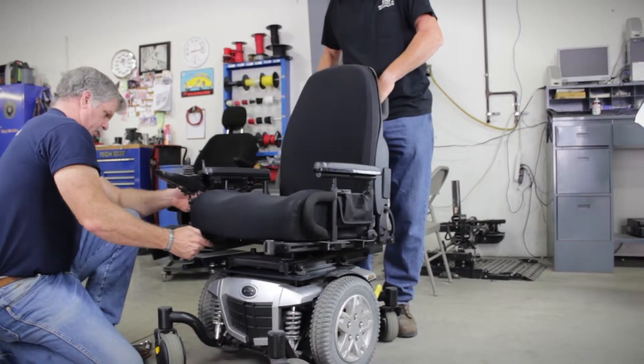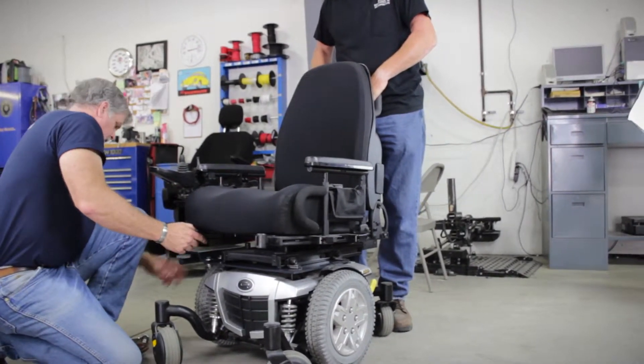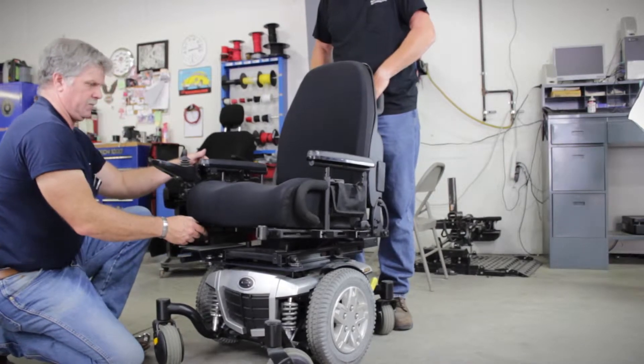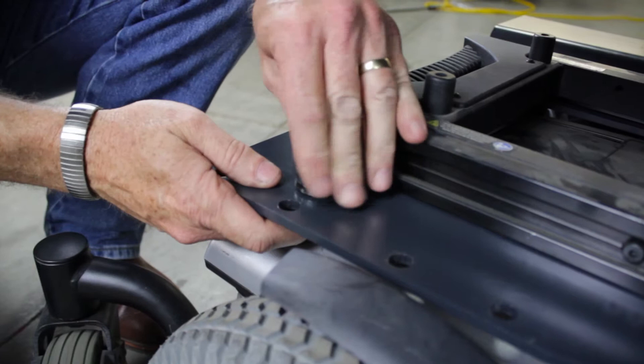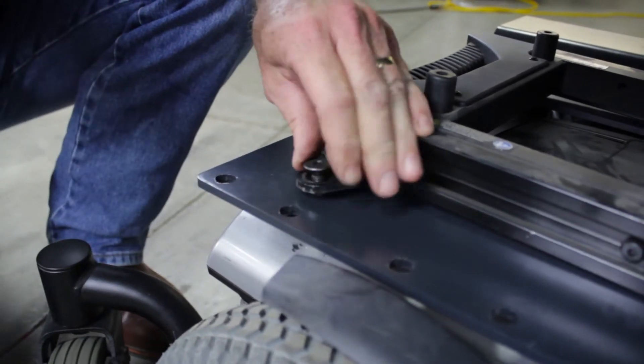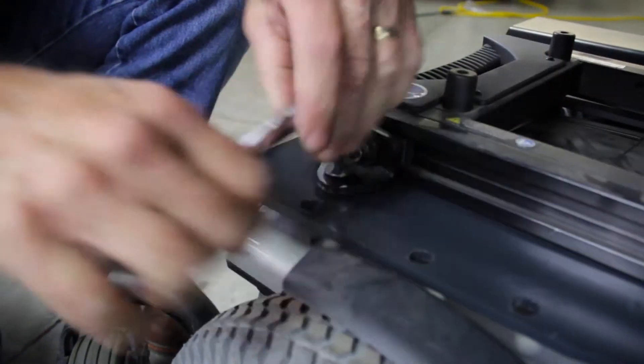Typically, the seat frame can be put back in place so that the bolts can be mounted. At this time, attach all frame brackets to the wheelchair and frame bracket itself. Tighten down once set.